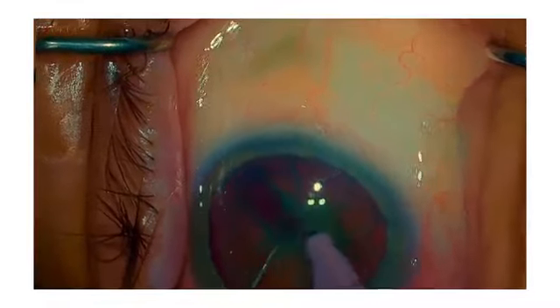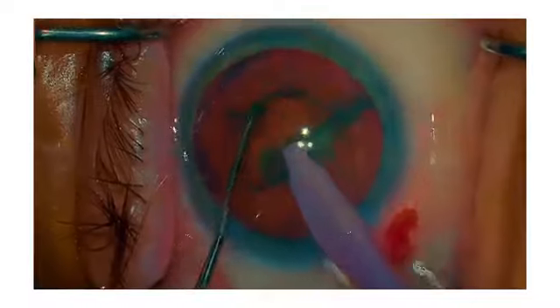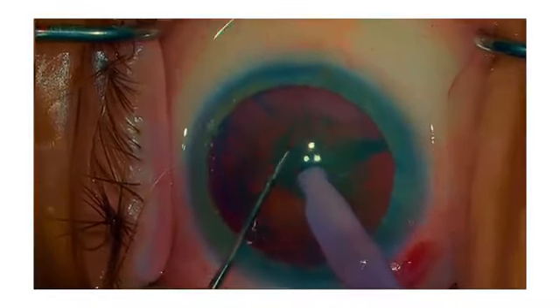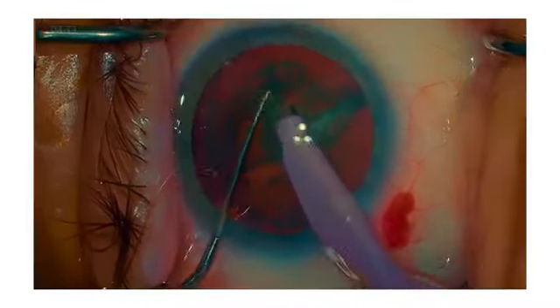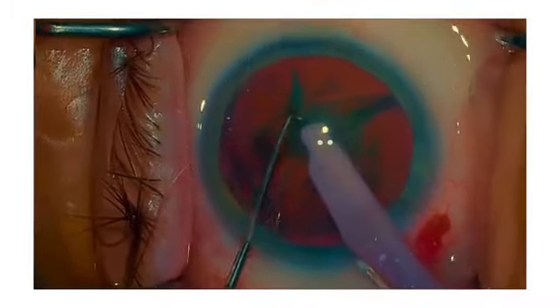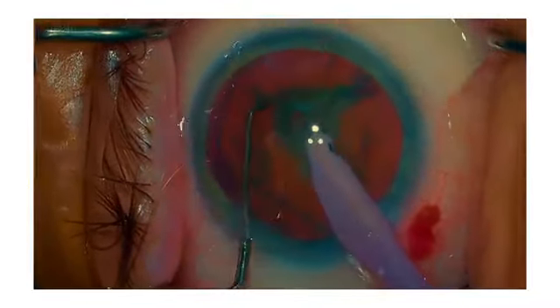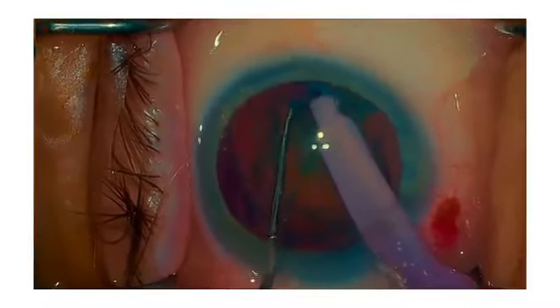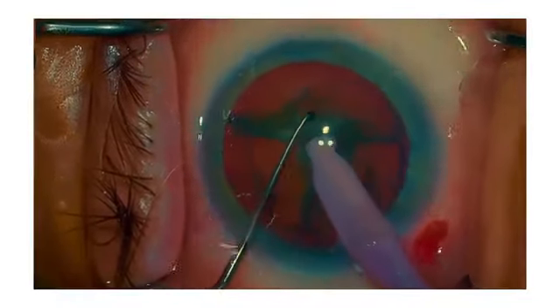The basic principle of phacodynamics is that in order to achieve anterior chamber stability during cataract surgery, we need to achieve a balance between the fluid that flows into the eye and the fluid that flows out. The fluid that flows in originates from the irrigation bottle and travels into the eye via plastic tubing and the phaco needle. The inflow may result from a pressure gradient, i.e. the bottle height, or by an infusion pump that will maintain a preset intraocular pressure during surgery.